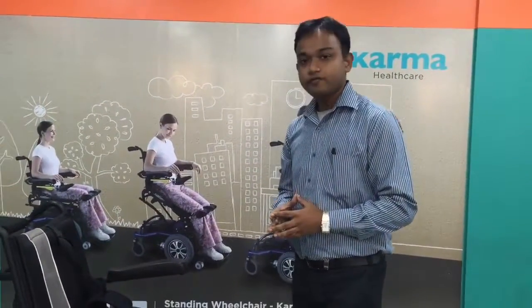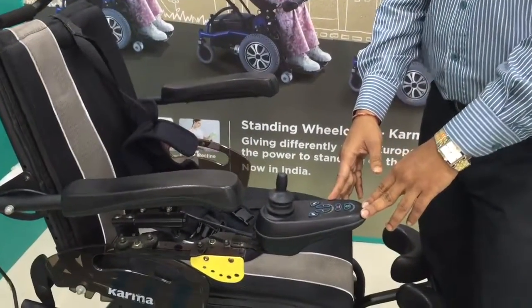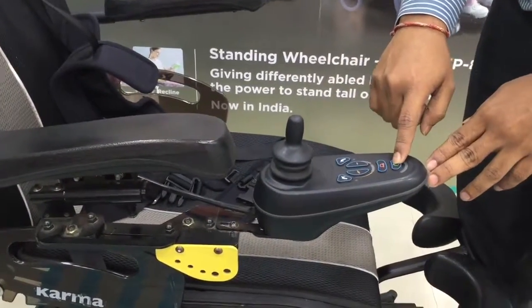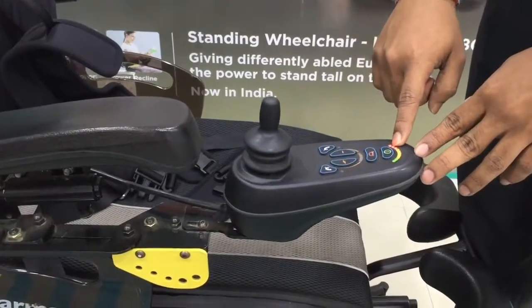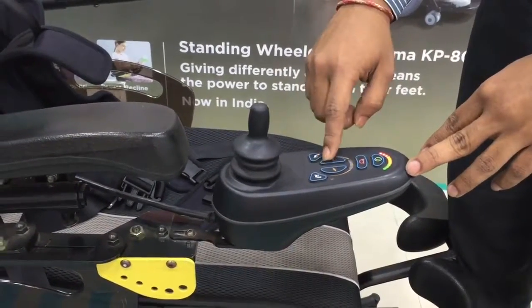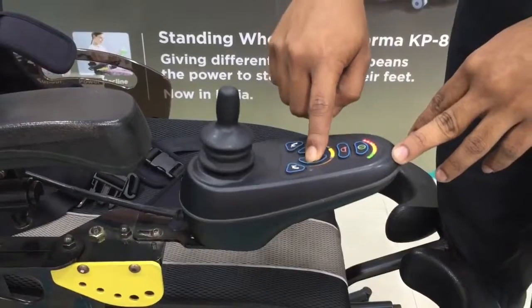Now I will show you the joystick, which is a very important part of any motorized wheelchair. In the joystick there are a few buttons. This button is called the on/off button. This button activates the horn. And these two buttons are for speed minimizing and optimizing — this one is for minimizing and this one is for optimizing.